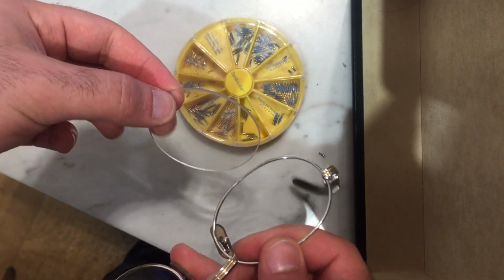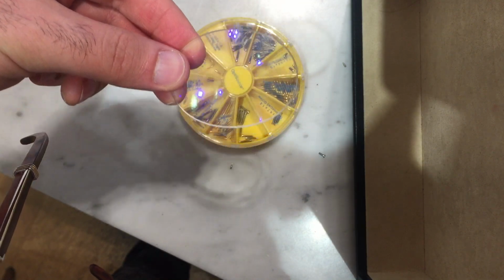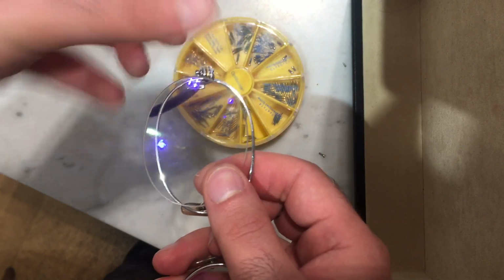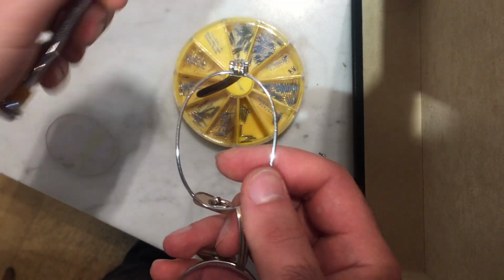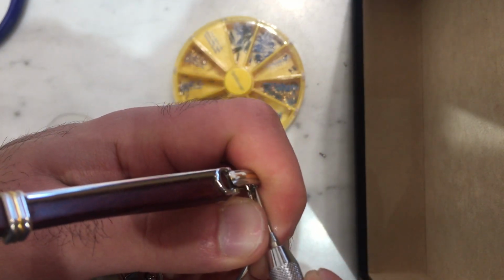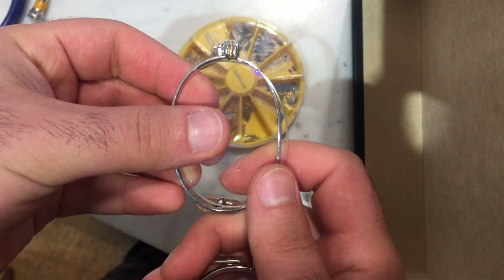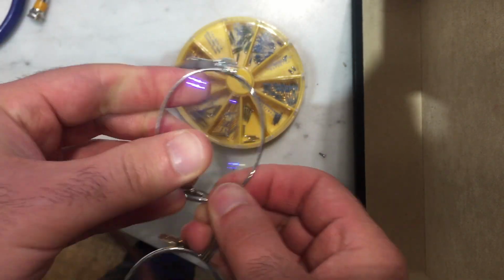There is my lens. It's a progressive lens. It's oval. It could go either way. I don't want to mess this up. So here we go. The distortion is here. That's my reading. It goes to the bottom. And typically, because this is going to be a tighter fit, I like to unscrew the screw in there now, just to give myself a little bit of room to insert this lens. Bottom goes to the bottom, and you stretch it over the lens.